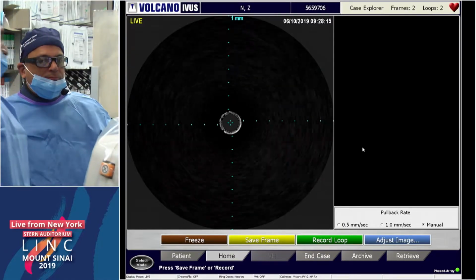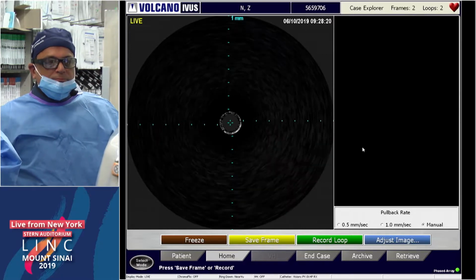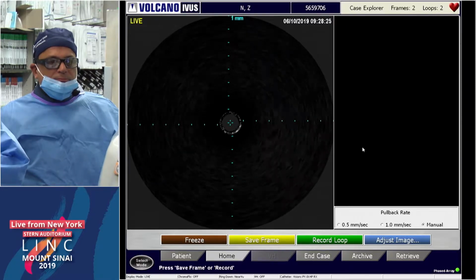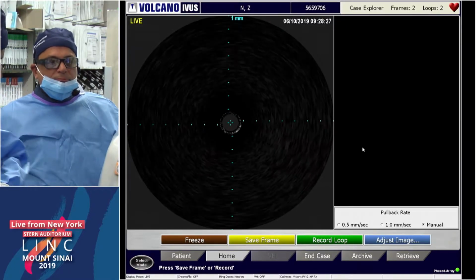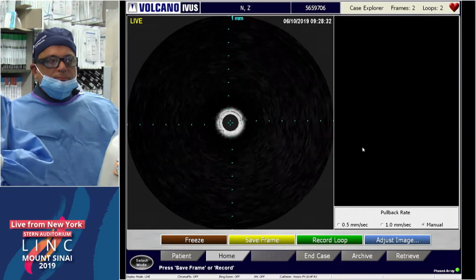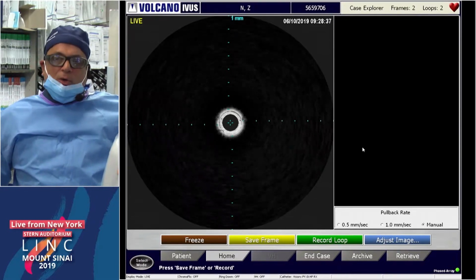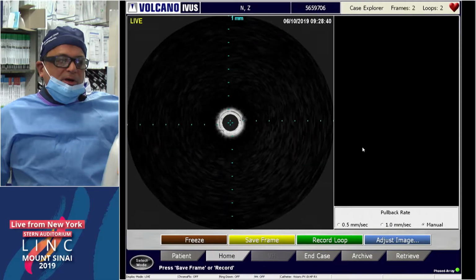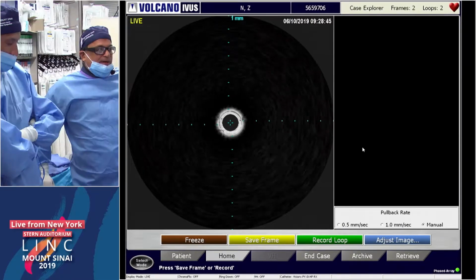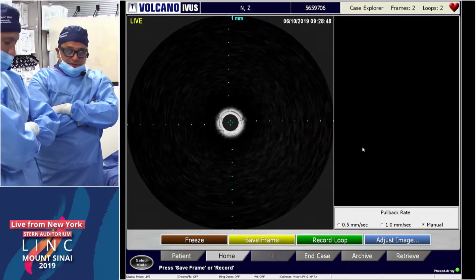And I think it's important to add in here that if we were to have an appropriate size vessel for the Supera, I think you'd still need to go in and atherectomize, because I don't think you'd get adequate expansion of the stent and probable elongation, which would be an ultimate problem with the Supera if you're not adequately prepped. So right now, just to let you guys know, we're doing a 7.0 by 40 Lutonix balloon. It went up very, very easily. Not at all high pressures. We're at nominal with nice expansion of the balloon. We're going to let it dwell for 2 minutes, but I want to just continue this discussion.